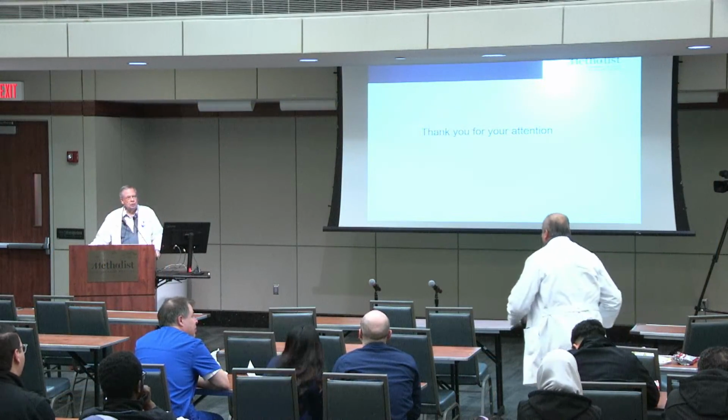I'm sorry, Dr. Shah, I did not mention CMR. Personally, I'll tell you my bias. I do use CMR, but it's when I'm using CMR for a particular disease entity that I value a lot the value of CMR, and then added to that the flow assessment. But personally, I don't use it as a first line for a chest pain evaluation.